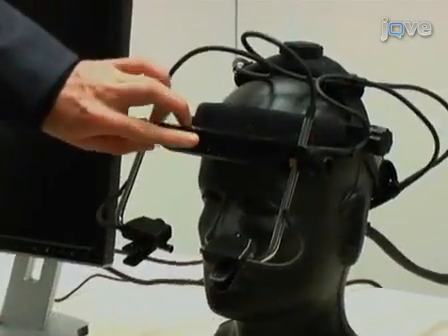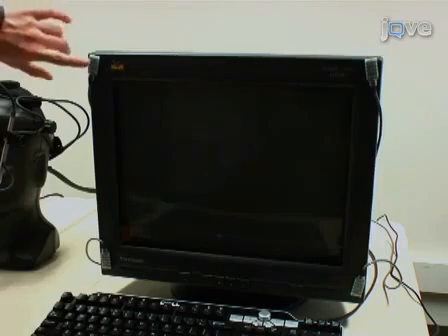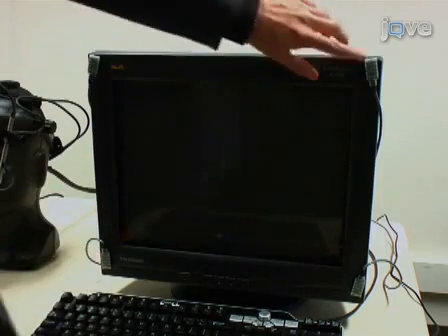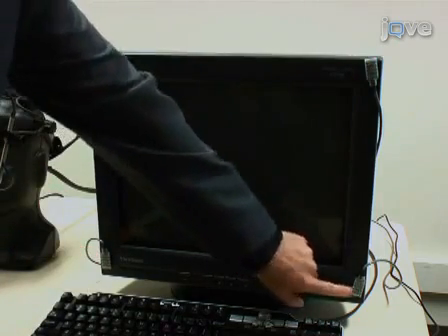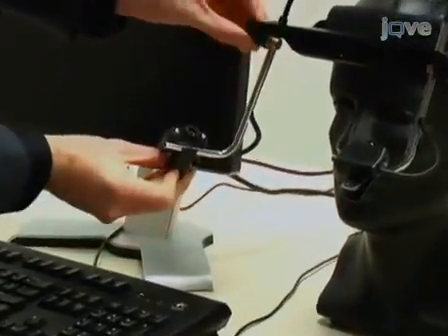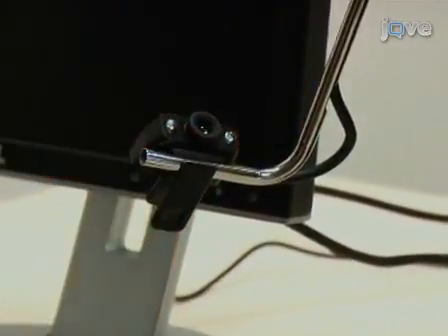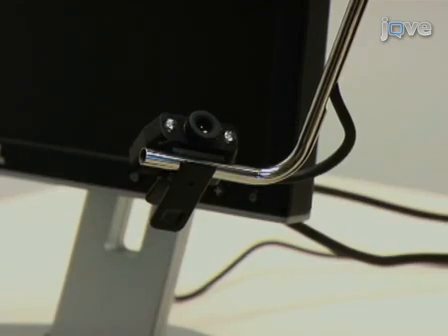One camera is used to monitor head position by sending infrared markers to sensors placed on the four corners of the display monitor that is viewed by the participants. Two additional cameras are mounted on the headbands situated below each of the eyes, and infrared illuminators are used to note the pupil and corneal reflections.